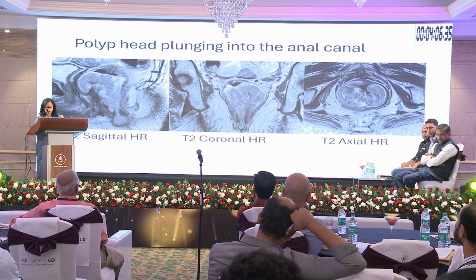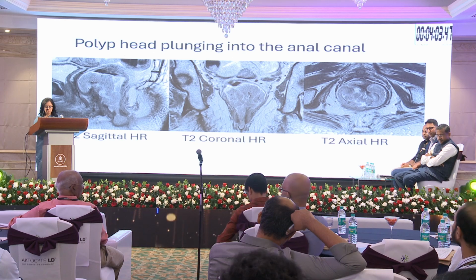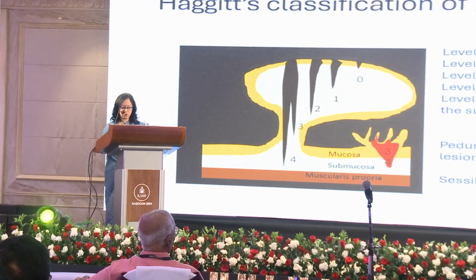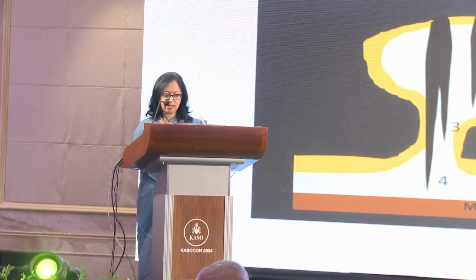This is another example showing you a similar finding where the head of the polyp plunges into the anal canal and protrudes through the anal canal. So what will help radiologists and us as an MDT team is to have common languages, and Haggitt's classification of protruding tumors helps radiologists understand very easily what is the direction of invasion of protruding tumors of the colon and the rectum. And similarly, having a common language like the Paris endoscopic classification and understanding it as a radiology community also helps us understand what is the invading margin of ulceroproliferative growths in the rectum.